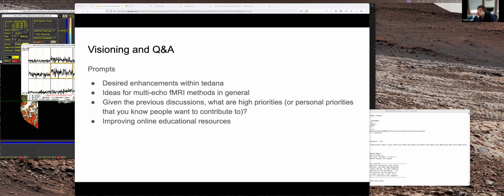We have played around with that in the past. I tried detrending before ICA or PCA, and ICA stopped converging on most of my test data sets. I'm sure I wasn't doing it in the best way possible. So I'm sure that there are ways to do it better, but in some ad hoc, thrown together tests, stuff started failing real quick.